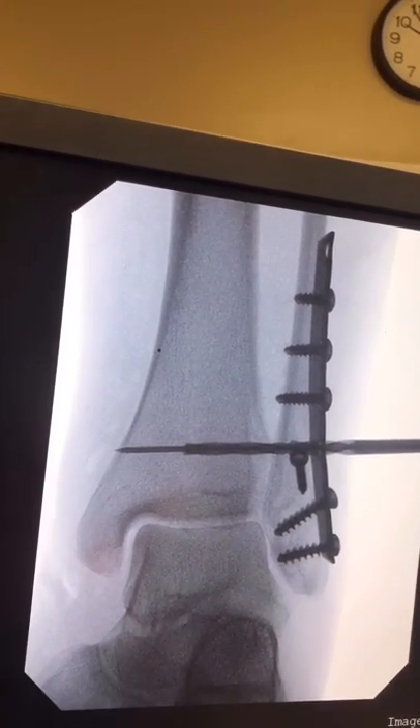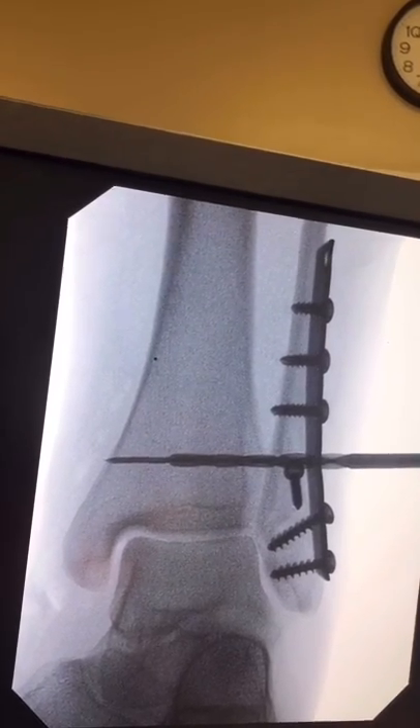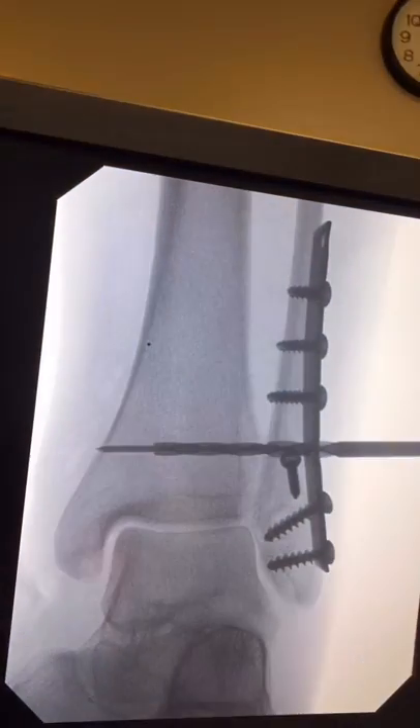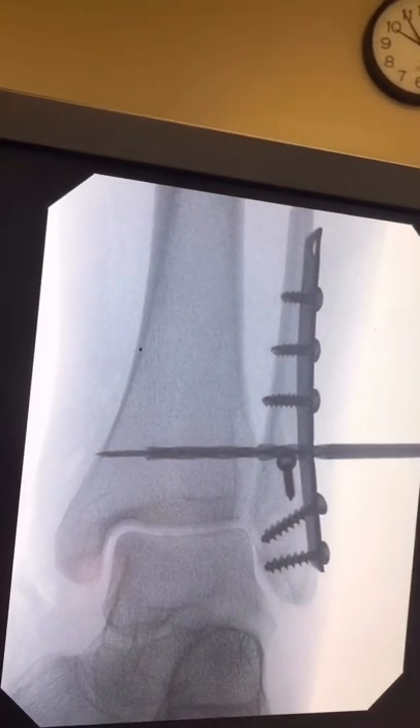Here you can see the drill is further introduced carefully, and finally, through the fibula only.